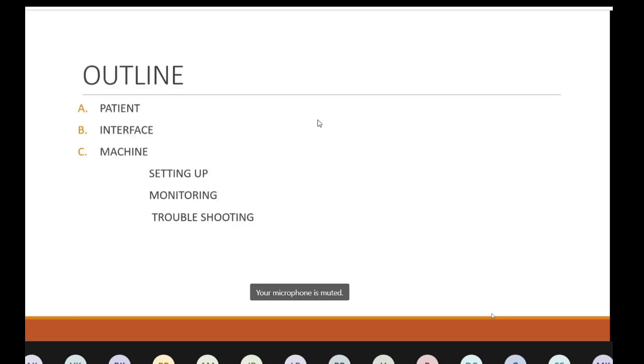See if you have attained adequate saturation levels or not. If your target saturation is more than 92%, if your saturation is 93, you are happy with your PEEP and FiO2, and you are happy with the patient, you can send an ABG, look at the PF ratios and continue monitoring this.